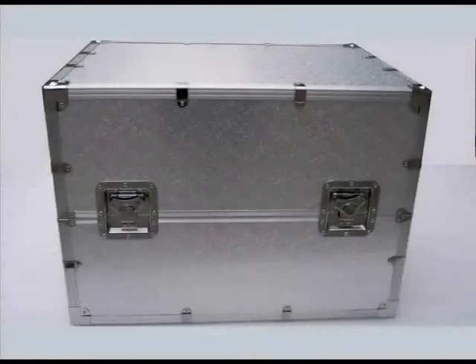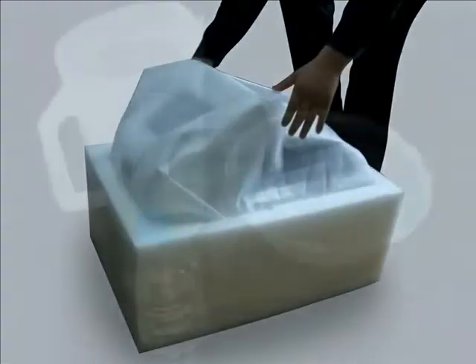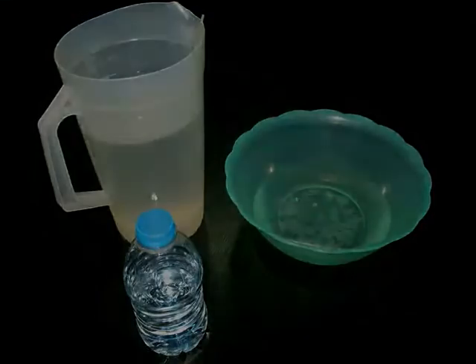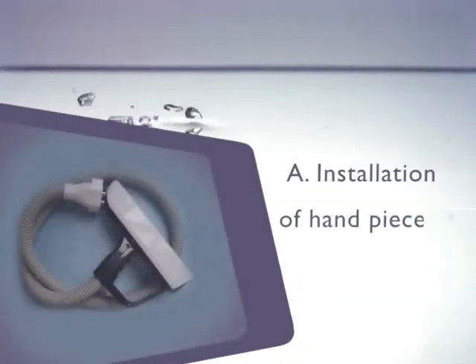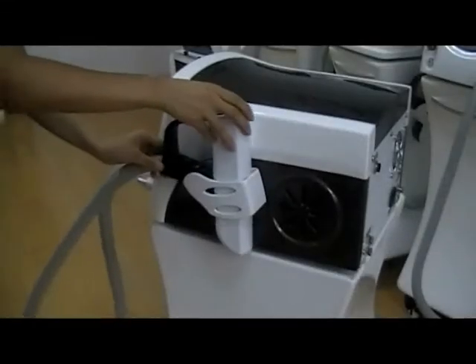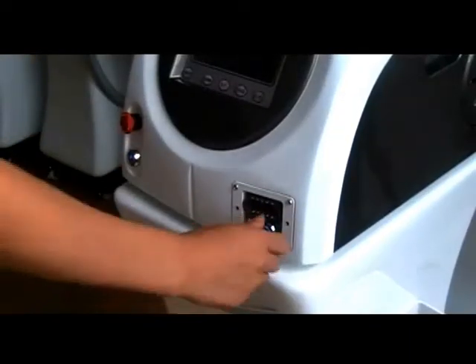Installation: please take the equipment and components out of the case. Prepare pure water or distilled water, about 3500 milliliters. Installation of hand pieces: hang the hand piece in the shelf of hand pieces, then pull out the stopples.